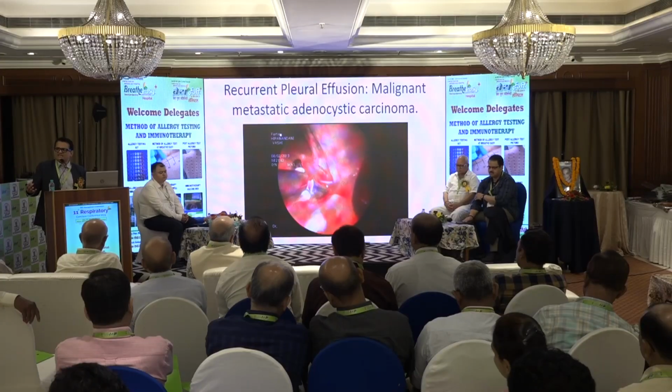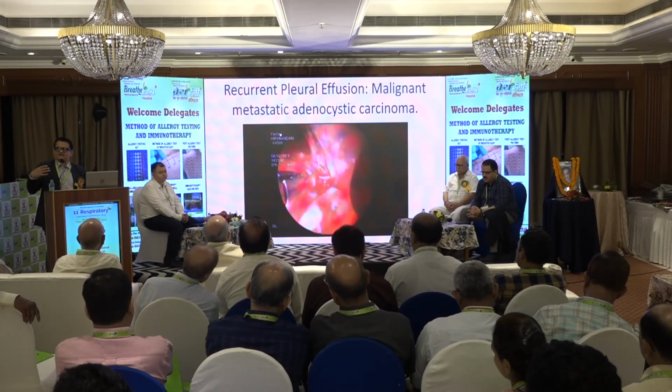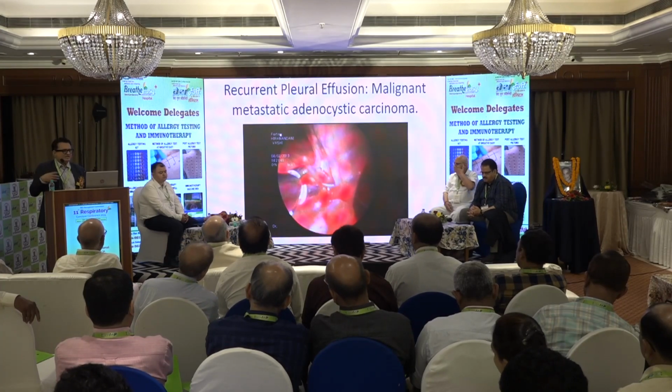Because the lung is expanding, we can also do what is called a pleurodesis for this patient here. Look at this. This is removing all the adhesions. Biopsy is being done here. So we could find these nodules, discuss with the family that yes, this seems to be malignant, and we can save an extra procedure at a later date. And I'll show you after this.